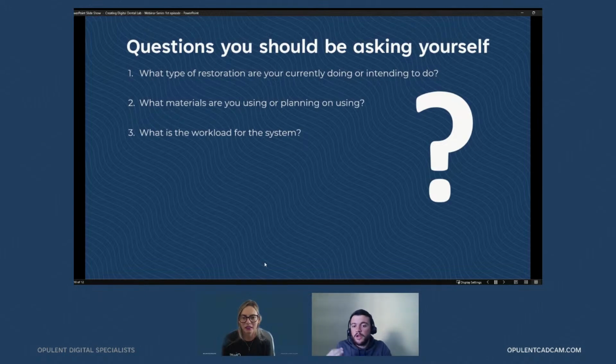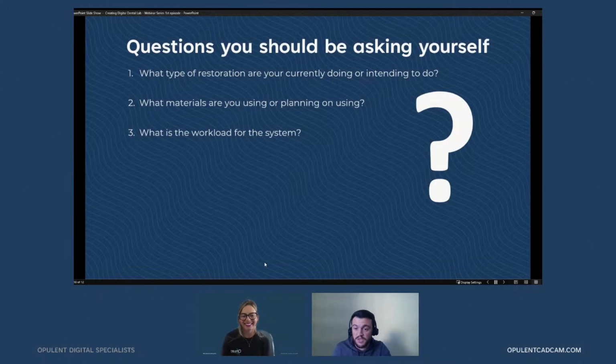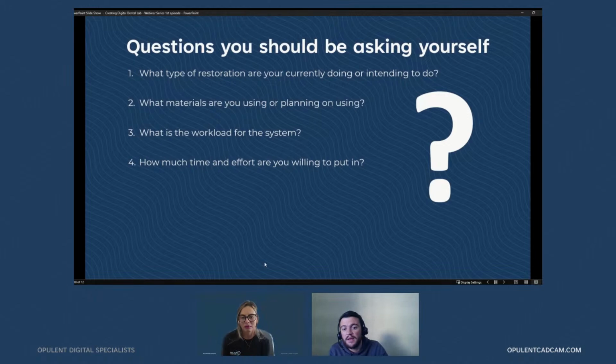Question number 3, what is the workload for the system? Basically, how much do you plan on using? How many crowns do you want to run in a day? Because that will depend. If you tell me, okay, I need to run 300 crowns a day, I'll tell you, okay, you're looking at 3 to 4 mills at least to run your operation. But if I know I'm only going to need 3 or 4, then you don't need that big of a mill. You can get something smaller that fits into your office or your lab much easier. So that will help you plan your workflow.